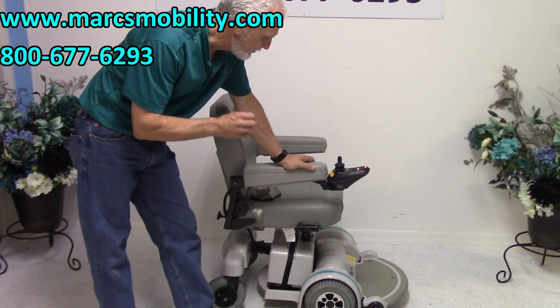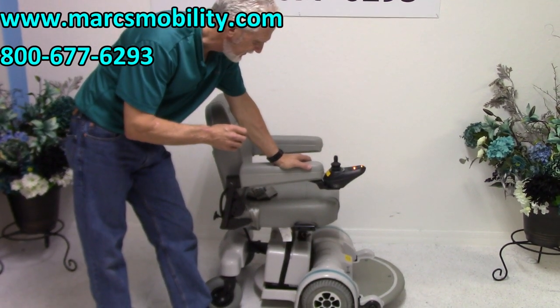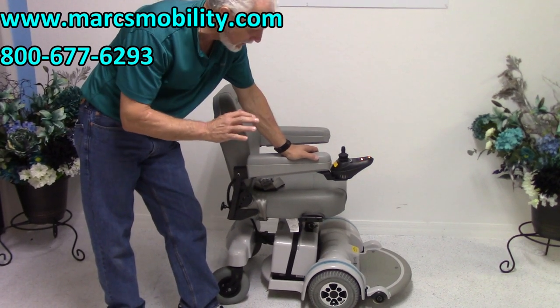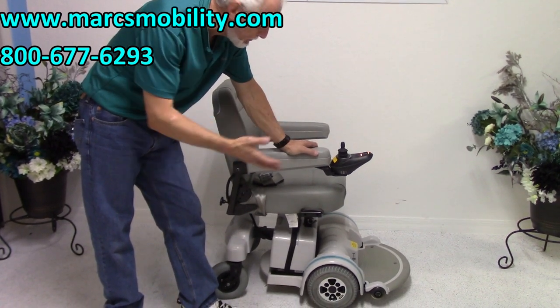This is a Hoveround MPV5 Power Chair. This power chair was used for about three or four months at the most — it's practically brand new. You can see the tires; the chair is immaculate.